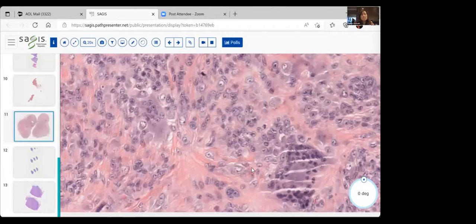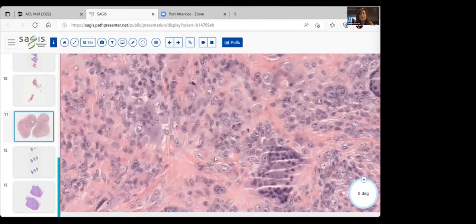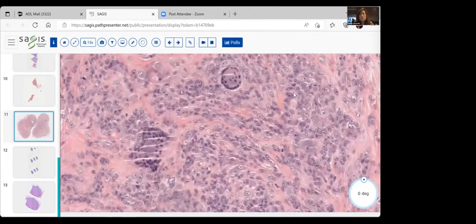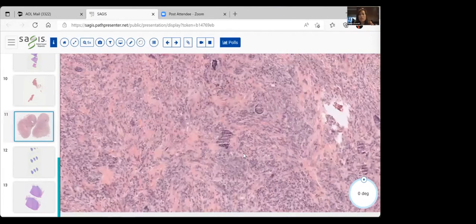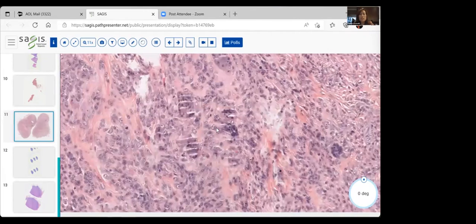You know, osteoclast giant cells trying to eat up bone, and they tend to stretch along the bone and be very long and spiculated. Well, this is the only other entity that has these osteoclast-like giant cells, where other inflammatory cells may mold against them. Let's see if we can look over here at some more examples of these large multinucleate giant cells. In the background of these cells, you see they're kind of round, oval epithelioid cells.